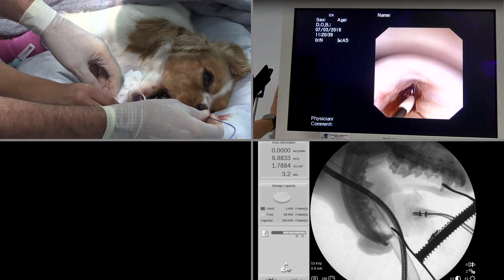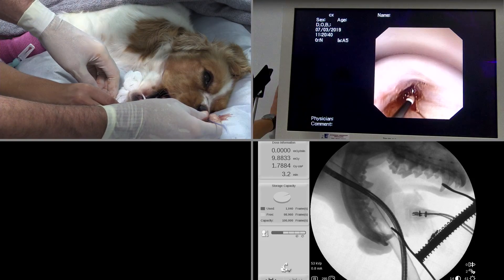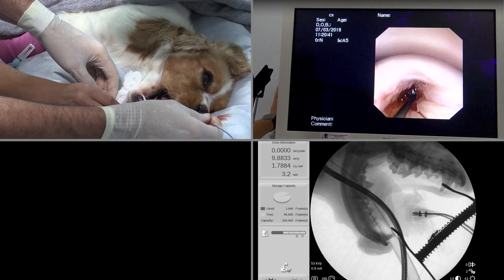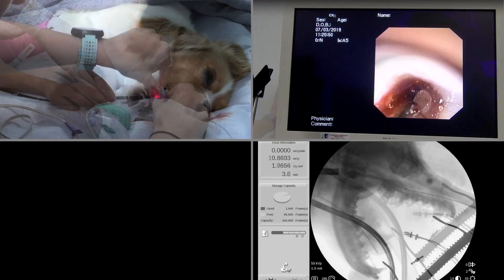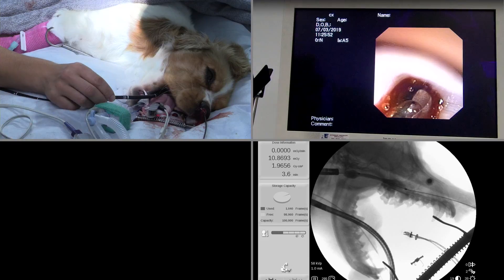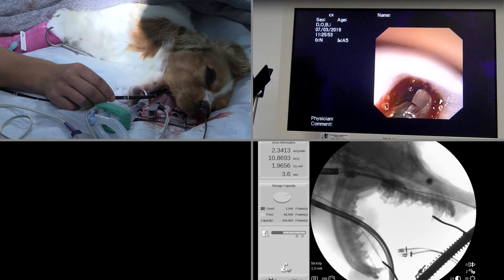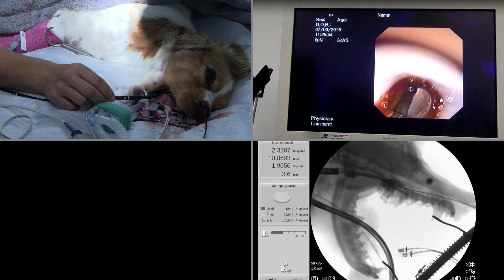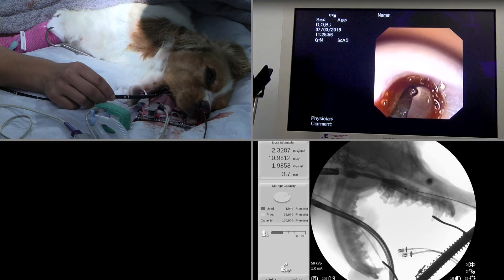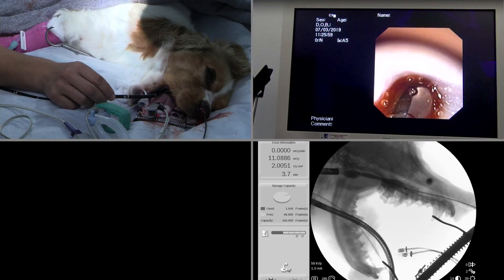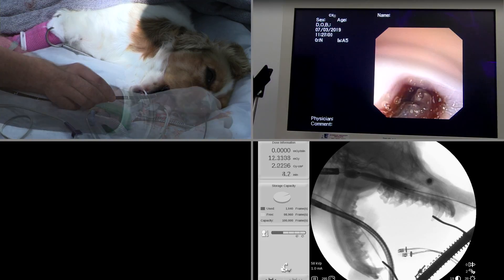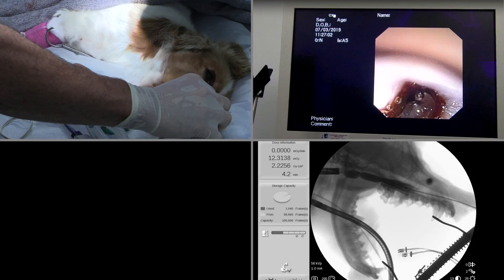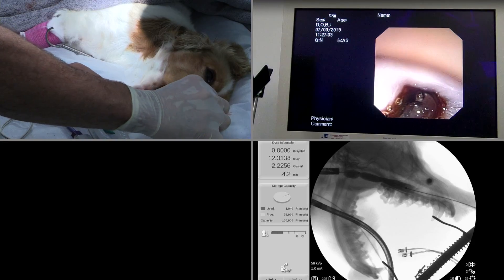Once we inflated it a few times, we were able to enlarge the nasopharyngeal region to a diameter of approximately 6 mm. After dilation of the nasopharyngeal stenosis, you can see that the contrast on the lower right-hand side completely fills the lumen.